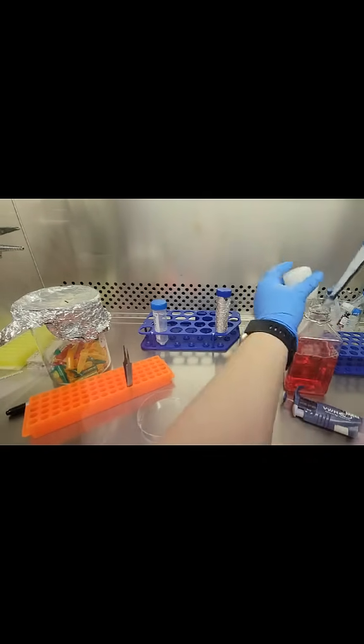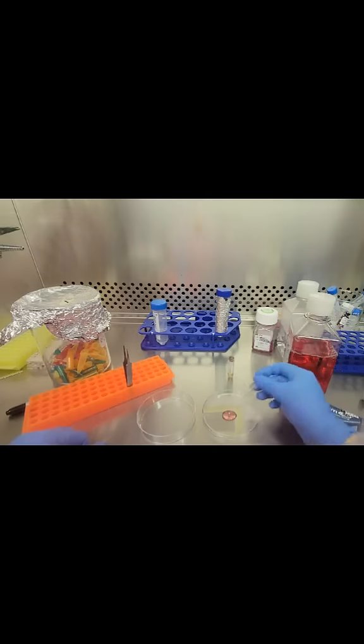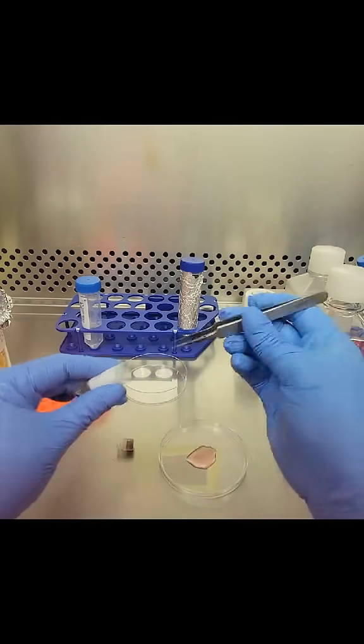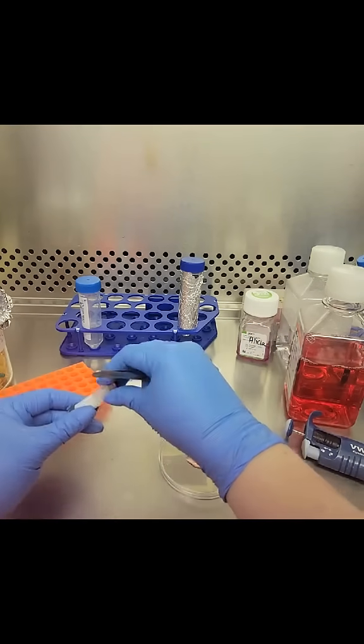The first thing I'm going to do is add a little bit of media to what I'm calling my cutting dish, which is actually just the top of a petri dish. Spreading out the media nice and thin, and then I'm going to take my sterile forceps and add the little puncture of skin biopsy directly onto the plate with media.